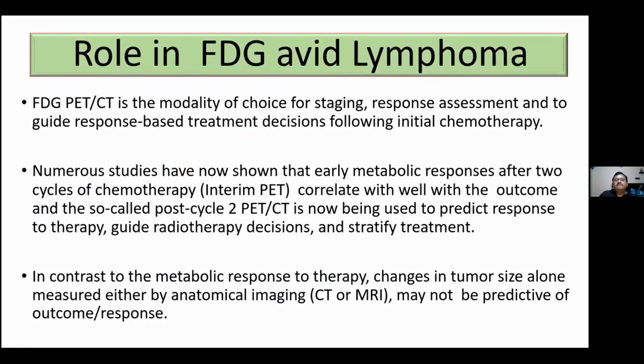Now, FDG PET CT is the modality of choice for staging, response assessment, and to guide response-based treatment decisions following initial chemotherapy.